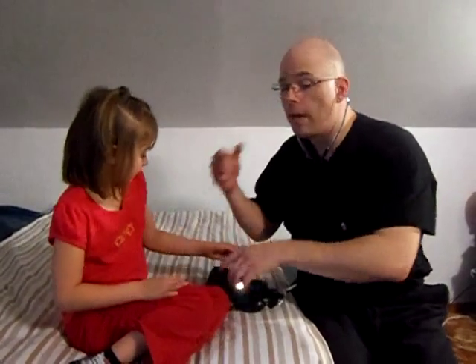Great. Well, we got 88/48. Which is a fine blood pressure for a 5-year-old, which she is.